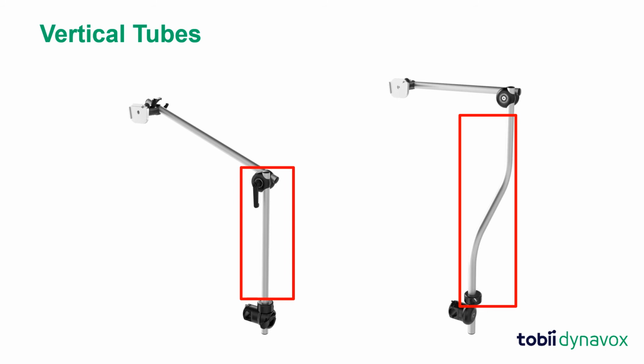An S-curved tube is efficient in that it eliminates the need for multiple tubes and flexible joints. This provides greater strength. In the Salesforce configurator, where you will be building your quote, there are 3 predefined lengths of vertical tubes to make ordering simpler. These are the child, young adult, and tall adult vertical tubes. The difference between these vertical tubes is just in the lengths of the tubes. Use these items when you do not have exact measurements for your client.